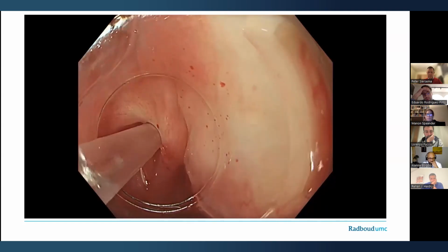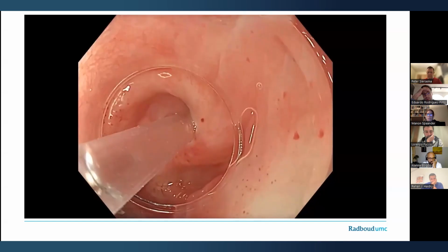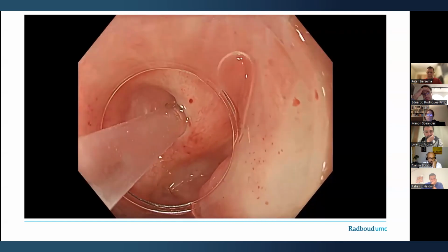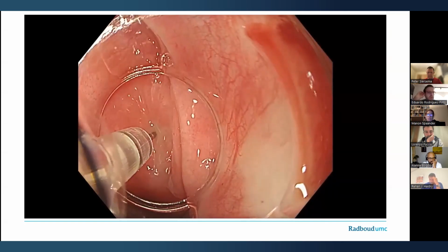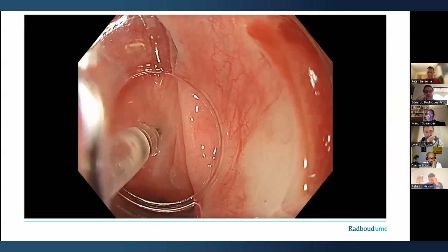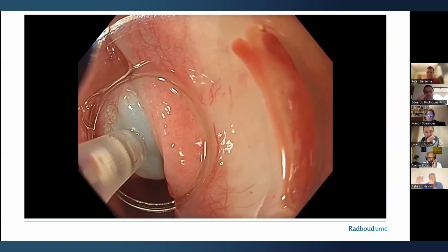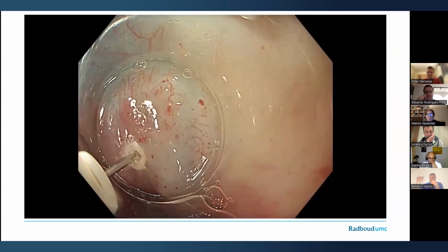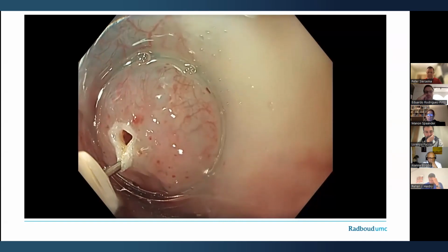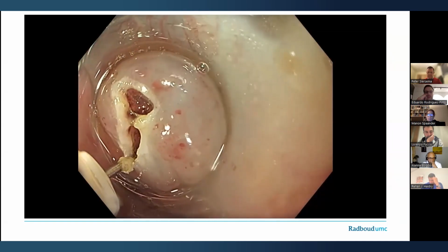A 2.5 millimeter injection needle can be passed through the opening. So the stricture was about 2 to 3 millimeters wide. We decided to perform a third space approach for stricturotomy. Initial submucosal injection was placed and a mucosotomy was performed about 1 cm above the stricture.